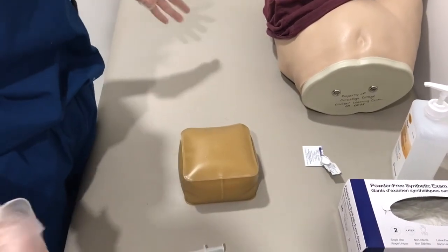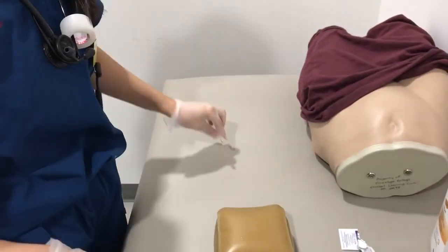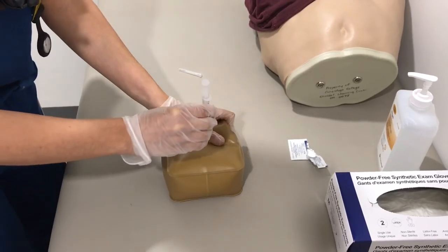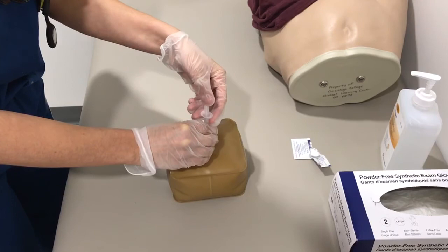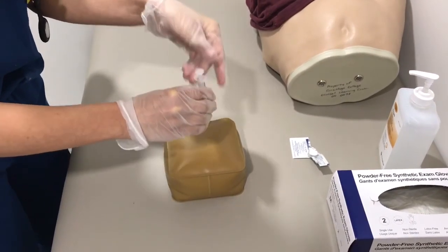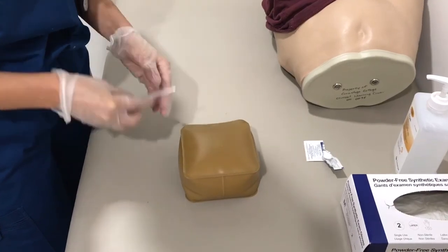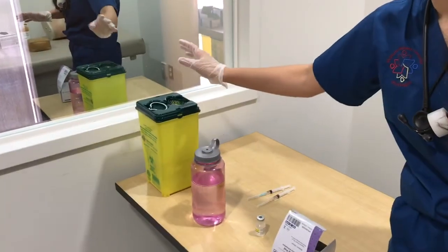And just to ensure that we give it appropriately. So what I'm going to do is, again, uncap my medication, and Dwight, this is going to go right into the spot where we landmarked before. I'm just going to be pinching it right here, and we're going to go in at a 90-degree angle straight downwards, let go, slowly administer the medication, and pull out. Again, what you would want to do is recap against a hard surface to prevent any needle stick, and stick this into our sharps bin.